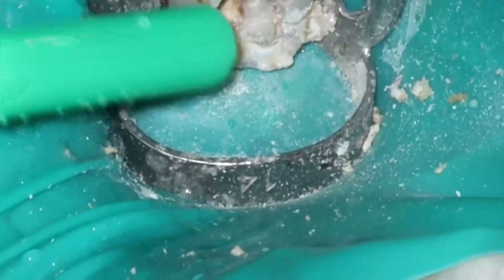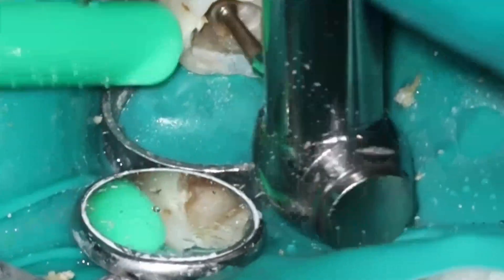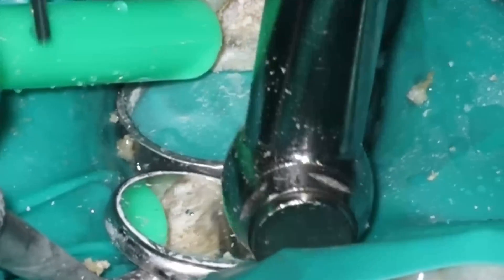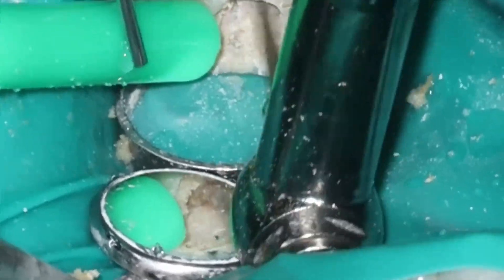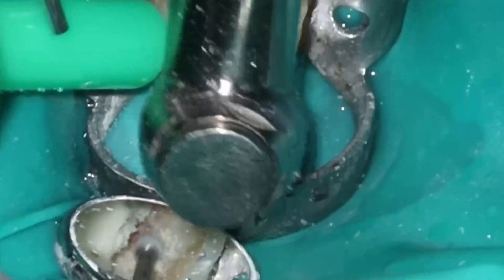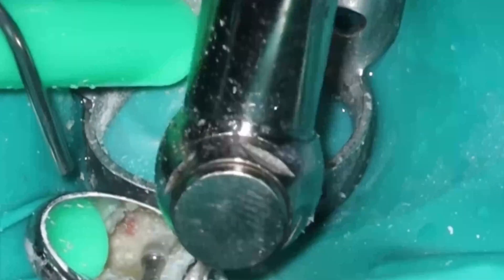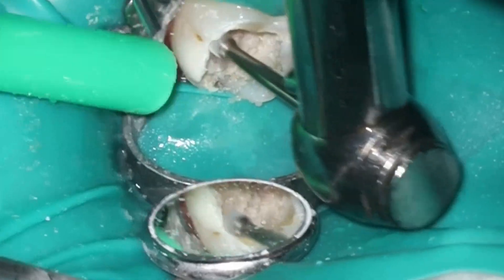Really nasty, leathery dentin, as you can see. So you want to get that all cleaned out because of the decay. As far as whether or not we could do selective caries removal in this case — patient was 18 — with how deep the decay is, this case was very, very inflamed. I actually had some trouble getting this thing all the way dry and calm down and stop bleeding. So whenever we see that much bleeding, I'm not highly confident in my ability to do selective caries removal, especially with how leathery and soft that decay is.